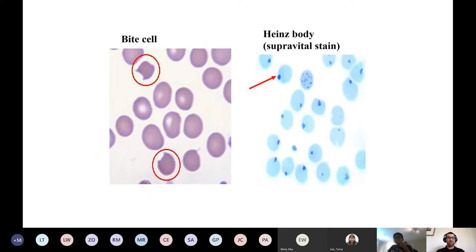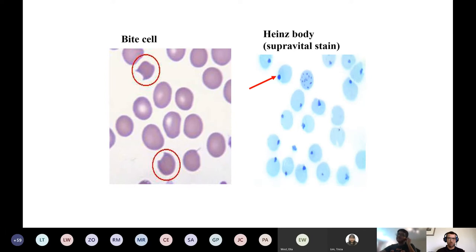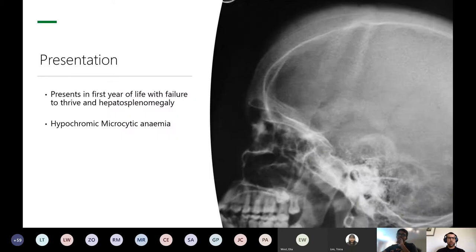Bite cells are what they look like - as if someone has taken a bite out of them. On a supravital stain, Heinz bodies appear as a little blue dot around the cell. Normal red blood cells should look nice and round with no blemishes - as you can see next to the bite cell, the normal ones look round with no blemishes.